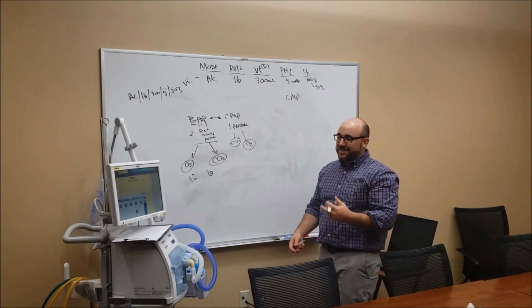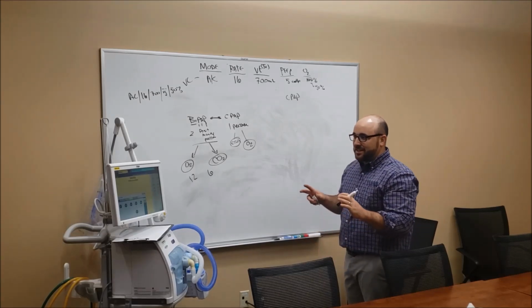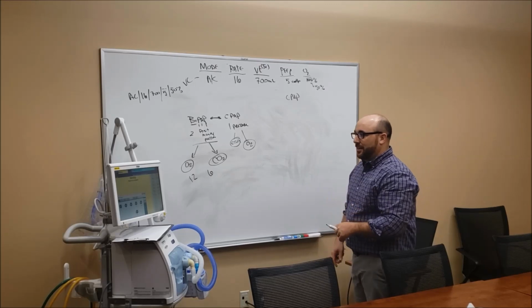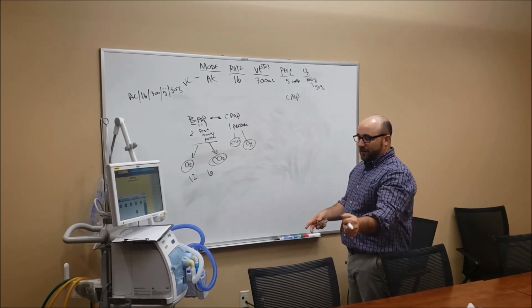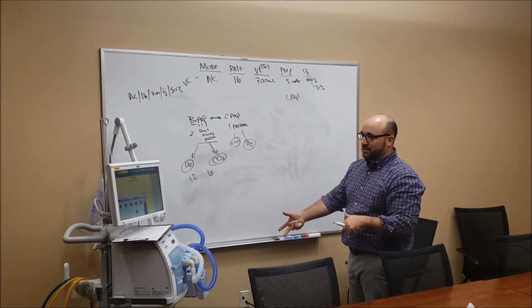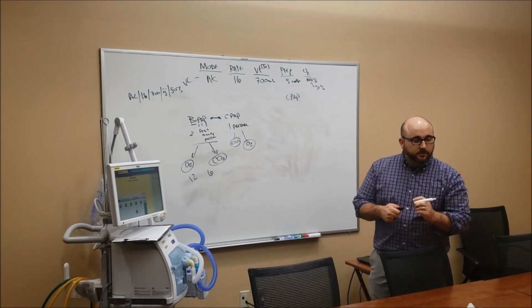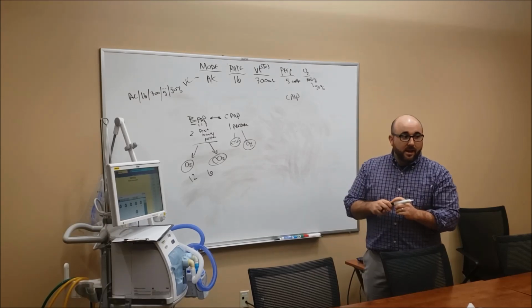So it's kind of confusing. We like buttons. That's the technology aspect of this generation, is we like changing things. The best thing to do is take them off, hook the bag valve mask up to 100% oxygen, and just ventilate them. Because it kind of suctions them, because I notice a lot of times they just need suction. Yeah, a lot of times they do need suction.